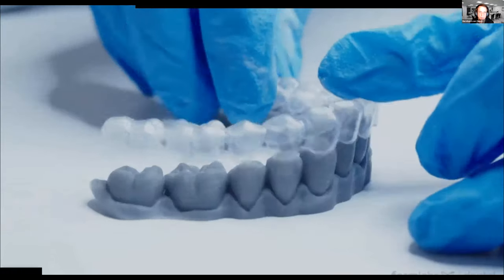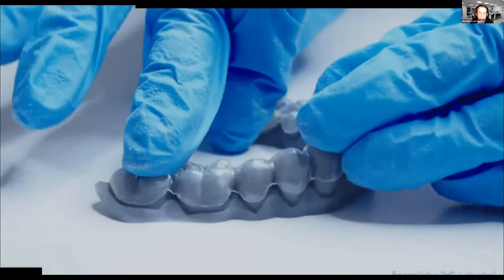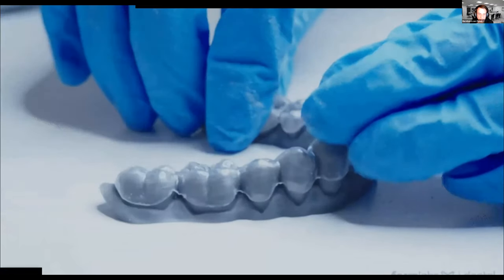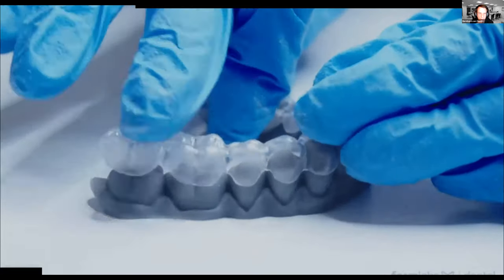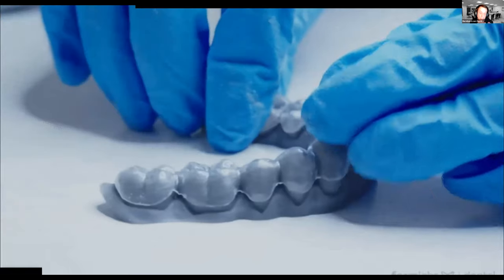Then there it is, your final product, the thermoformed aligner, a finished aligner ready to be delivered to the patient. The shaping of the aligner, as I said, only takes about 10 to 15 minutes for a trained technician. And actually it was really fun to do. I at least love it.